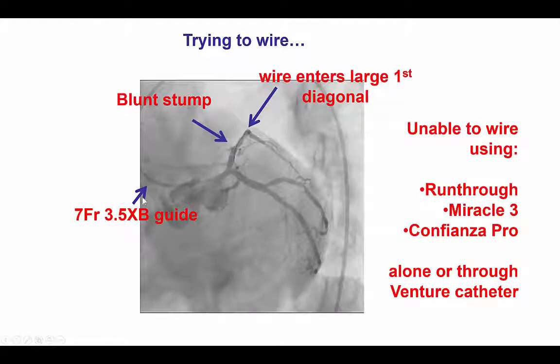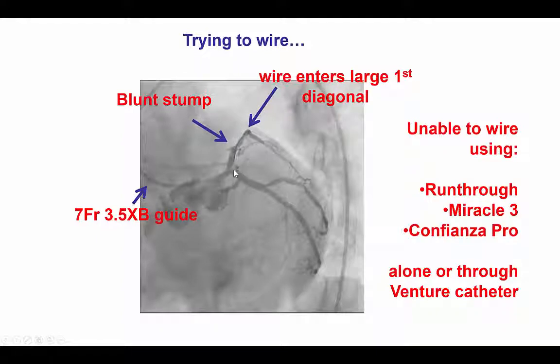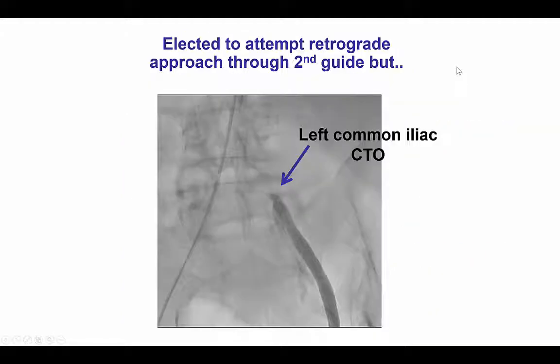We tried to wire through the LAD CTO antegrade. We used a 7 French guide, which is acceptable even today, and then tried to cross with the equipment available at the time — Workhorse wires, the Miracle-T, and the Confianza Pro 12 — advanced either alone or through the Venture microcatheter, trying to point them toward what we thought was the proximal cap. Today, with a dual injection, it would be much more accurate about where the wires should be directed. Unfortunately, this was unsuccessful.